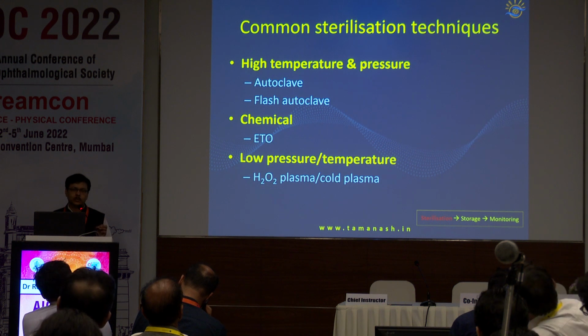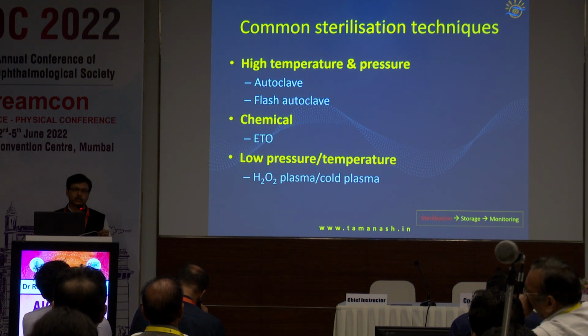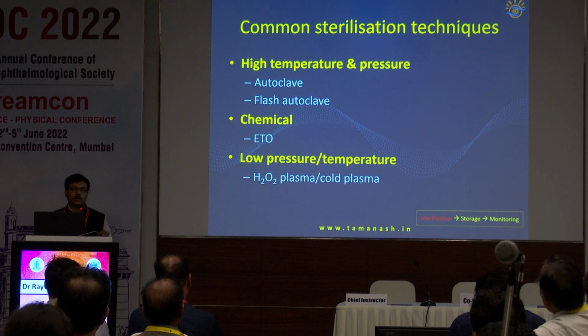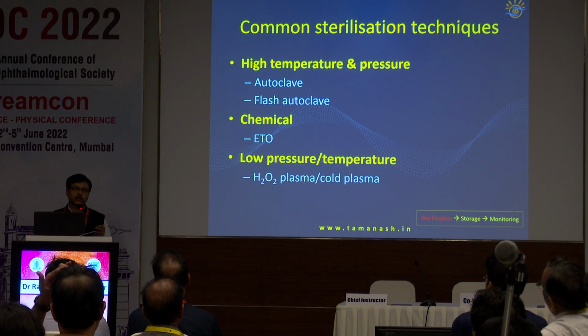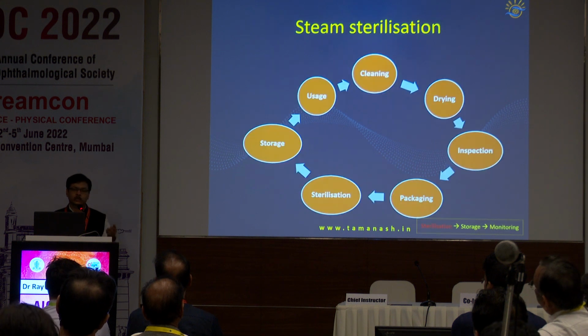The second most important thing would be the OVDs and solutions that you are putting into the anterior chamber, because if they're not sourced from good quality pharma companies who maintain the sterile chain, that can also land you in trouble. Probably the least important would be the OT air, because I have seen many OTs where OT air is not maintained at all. Not to send a wrong message, it's not that it's not important, but in the whole list that you have to check when starting an OT, the autoclave should come in first.